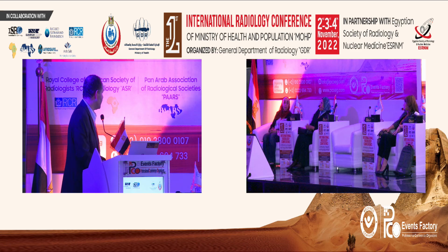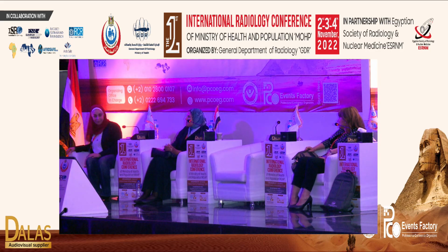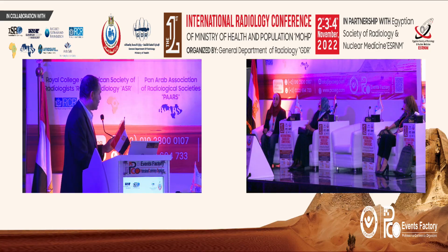I would like to ask another question. If both MRI and CT are available for enterography, which one would you prefer? That's a tough question, but I usually start with CT because everybody is familiar with CT. CT has what we call high spatial resolution, where you can take slices of less than 1 millimeter.